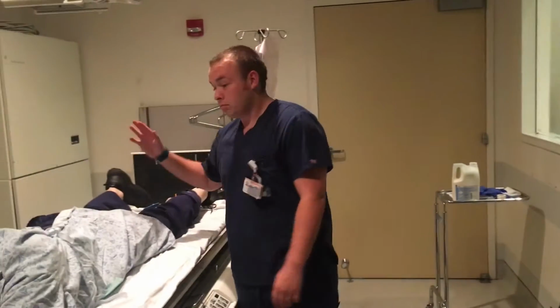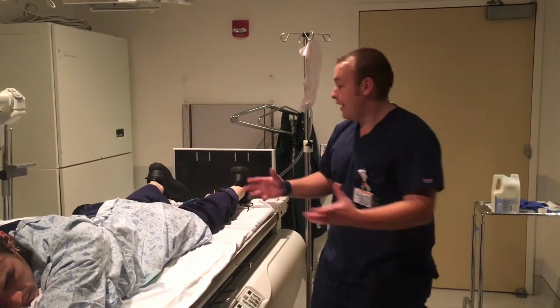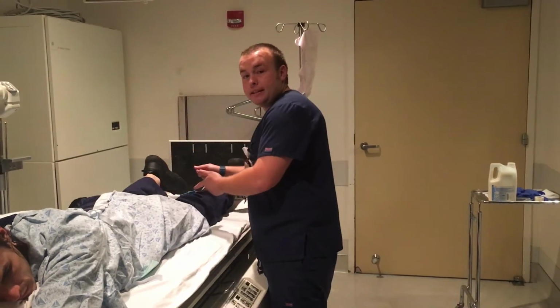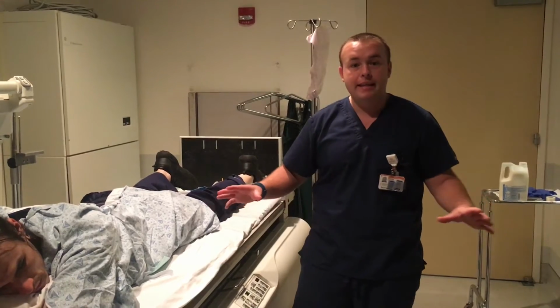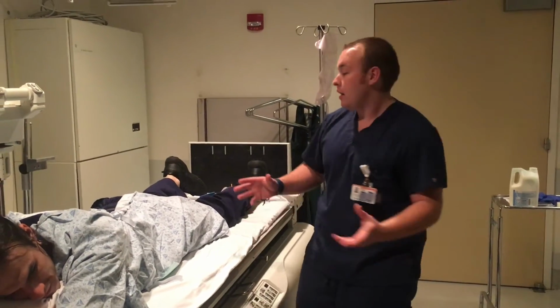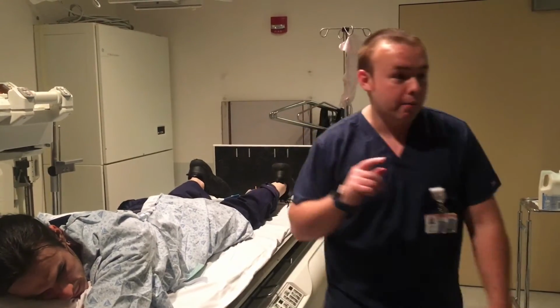Alright, so we're on to our last image. We're doing the PA post-evac. Right now I'm about to pull out the tip. We're going to have the patient go to the restroom, try to evacuate any barium that they can or anything that's in there. And then we're going to do one more image to see what it looks like. Let me grab a towel real quick.